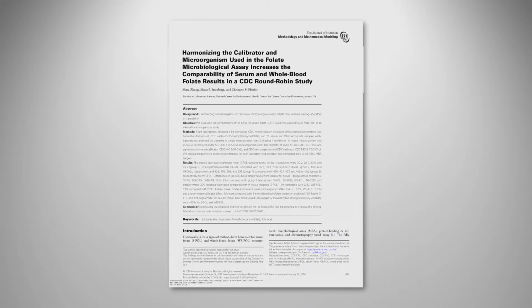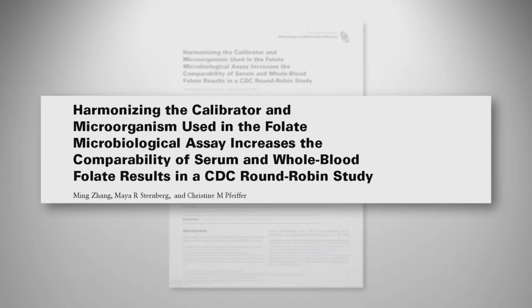Furthermore, recent findings show that when different laboratories use the same critical reagents, such as the microorganism and calibrator, in the microbiologic assay, the comparability of their results improves.